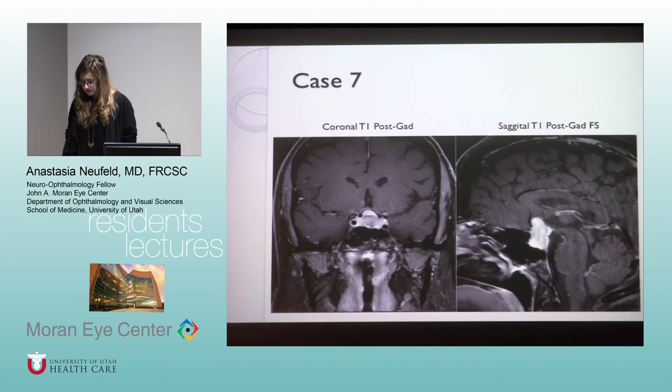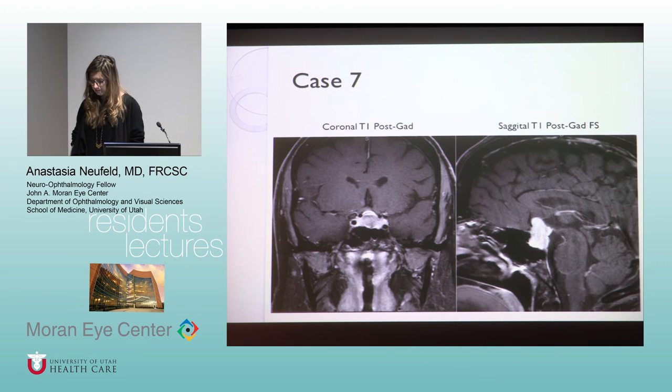All right, so this is her MR, which showed, of course, chiasm compression from below. I don't know if you can even see a little bit of it there. And she was operated on.